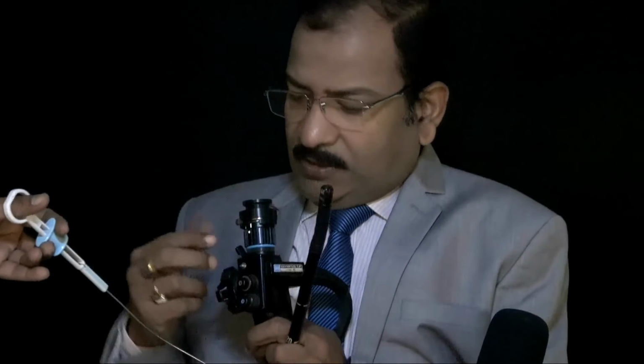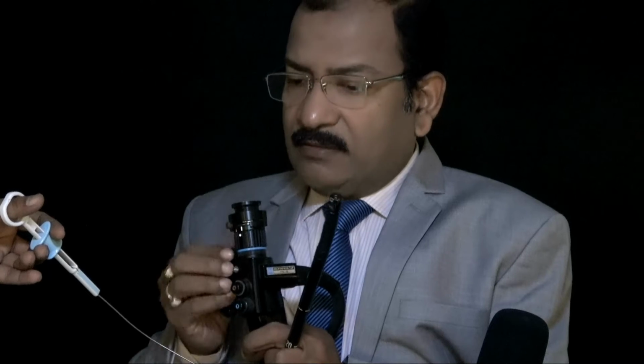Here, and after that, see, it is going straight. If it is going straight, how can I do the ERCP? So you can change the direction by this knob, and see, once I pull it, it will change the direction right and left. I would like to show you here. See, it is bending. Can you see that? The tip of the instrument is bending.